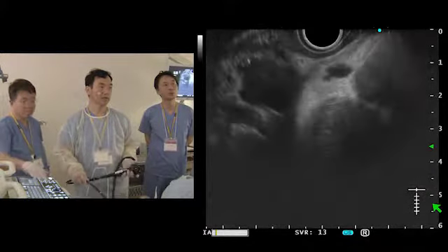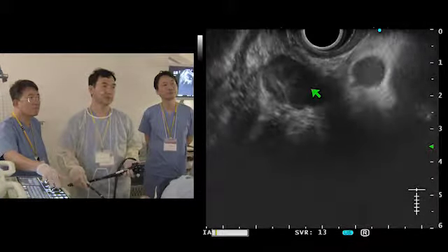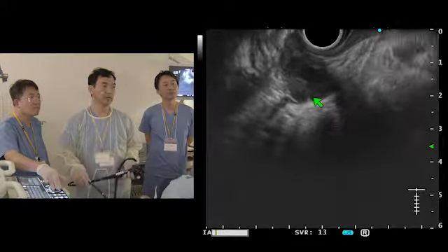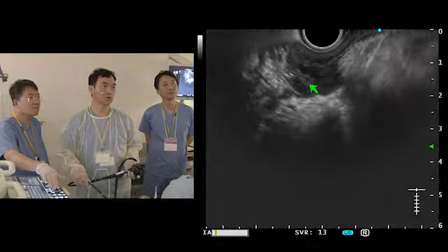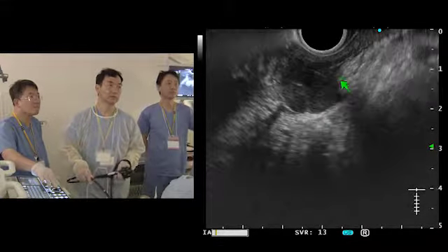That's a cardiac examination, but we just skip through. The tumor actually is distal to the heart. You can see the muscularis propria layer on the esophageal wall. Let's freeze this here.